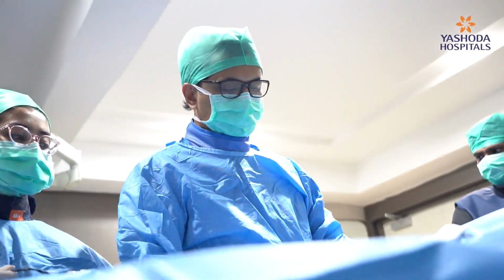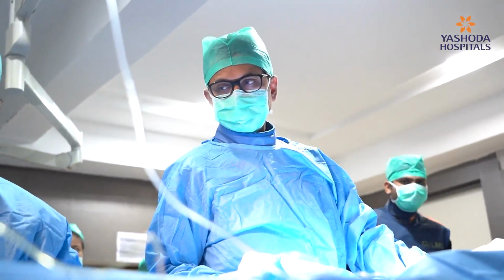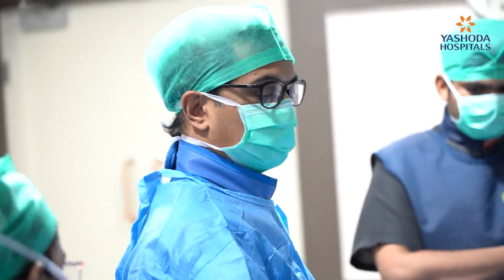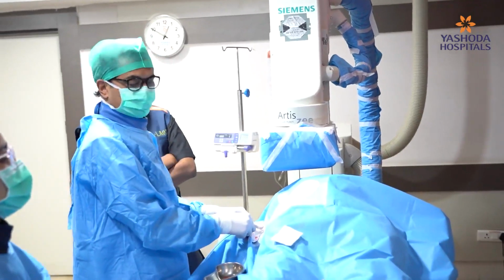So are there any particular advantages when compared to conventional surgery, doctor? TAVI or TAVR confers many advantages to the patient. One important advantage is it requires a much shorter hospitalization. Most of the patients can walk out of the hospital within 48 hours after the procedure. Second major advantage is it doesn't require general anesthesia. There are no cuts or surgical marks on the patient. It can be done through a small hole in the patient's groin, in the artery. And it carries much less morbidity and mortality compared to surgical aortic valve replacement.